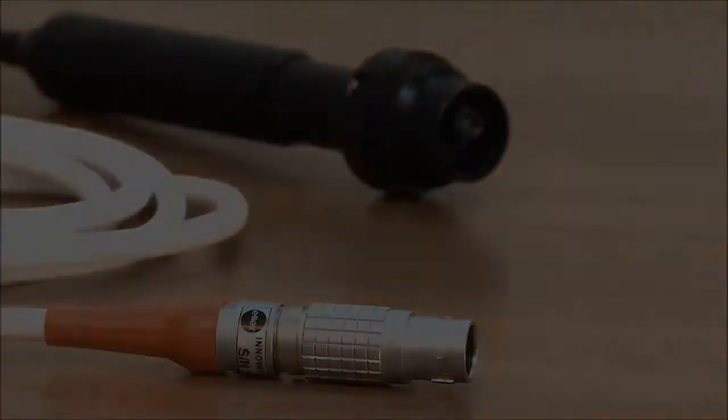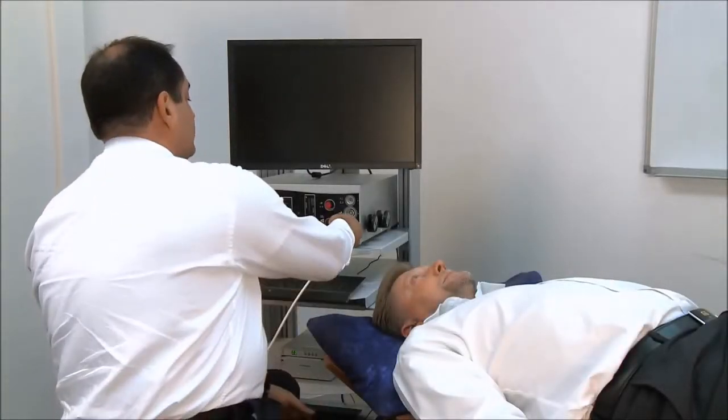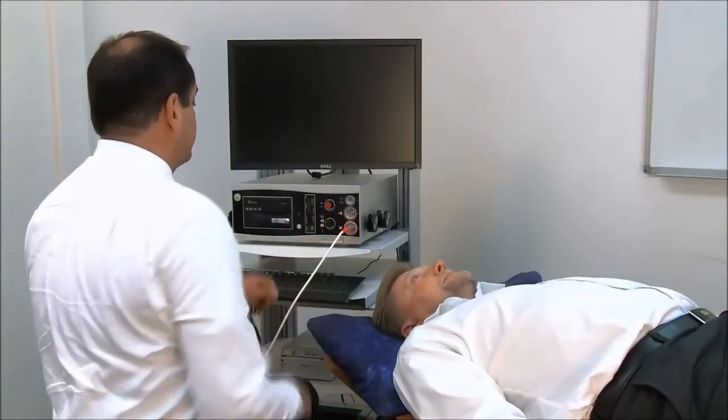The first step is to ensure that the 40 MHz probe, the orange connector, is connected to the iCubed and to turn on the system.